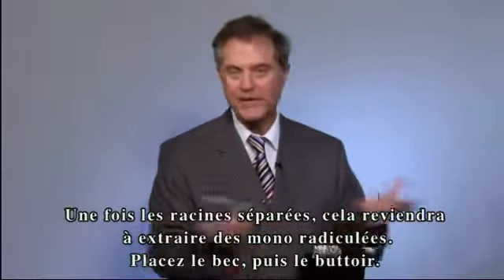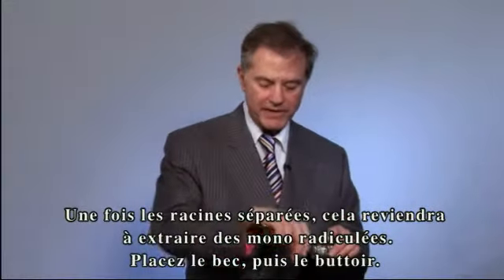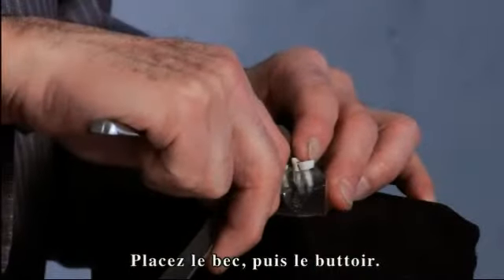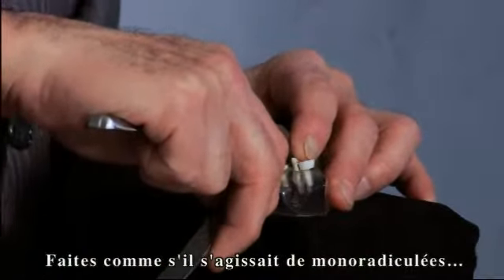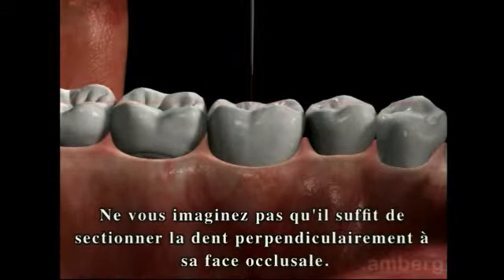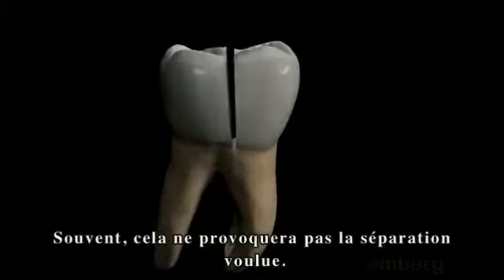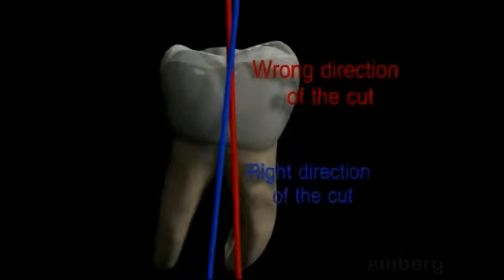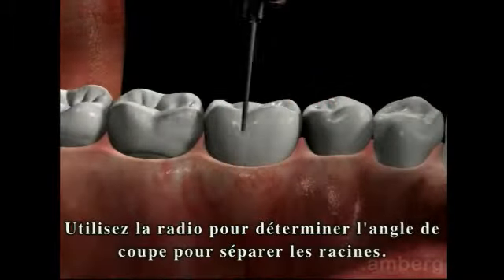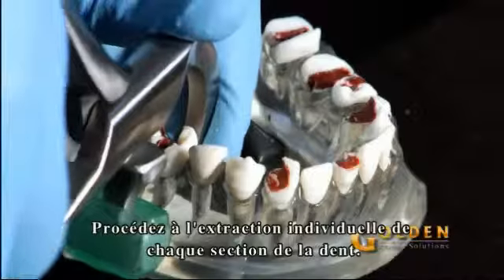Once you separate the two roots, it becomes like taking out a bicuspid. Beak and bumper. This tooth in this condition is really a 30 to 40 second — maybe a minute — extraction. Place the beak and the bumper and take them out as if they were individual roots. Wait for the energy to build up and the tooth will rotate out. Do not assume you can simply section the tooth perpendicular to the occlusal plane — quite often this will not accomplish a separation of the root. Noting the x-ray, angle the drill according to the angle of the root. Take another x-ray to ensure the tooth has been completely sectioned, then use the physics forceps to remove each individual section.